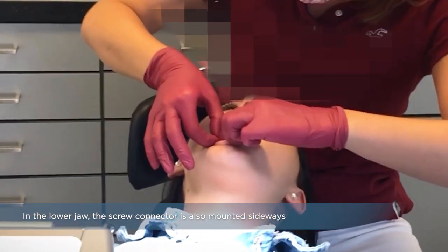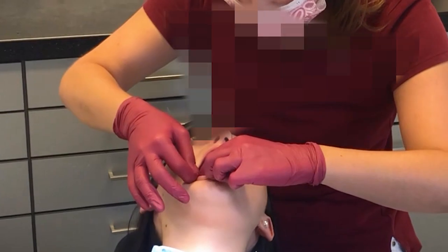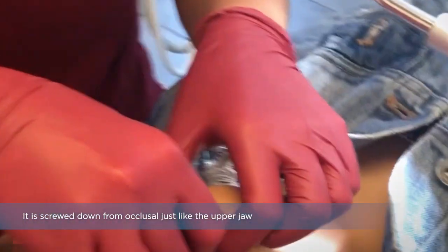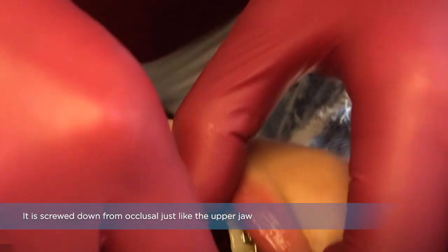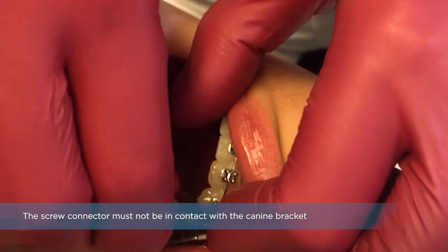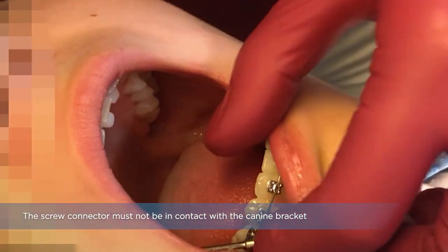In the lower jaw, the screw connector is also mounted sideways. It is screwed down from occlusal just like the upper jaw. The screw connector must not be in contact with the canine bracket.